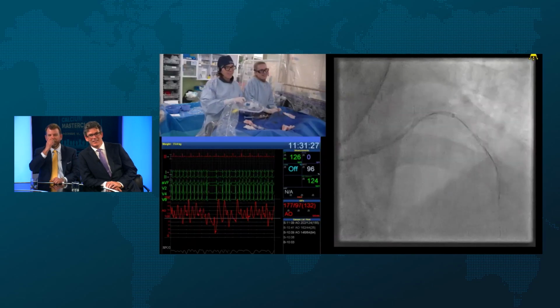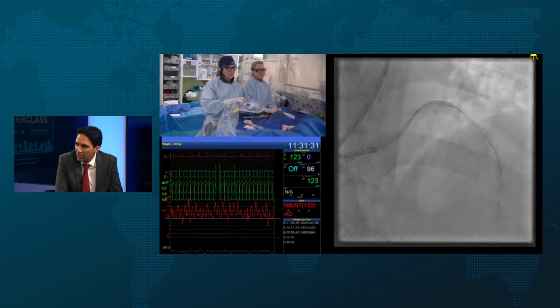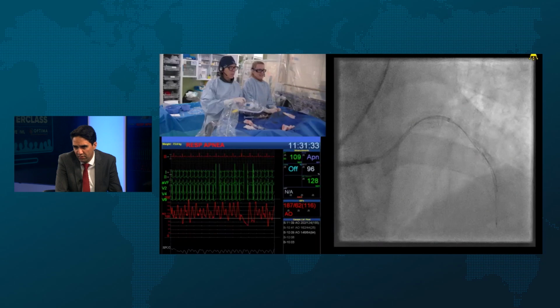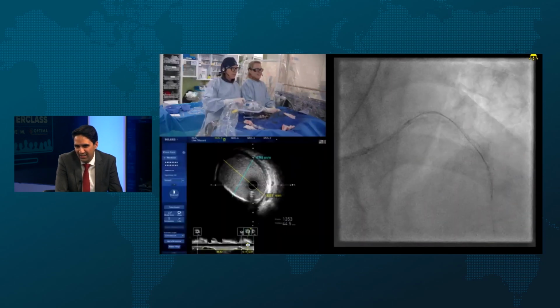So maybe go live on what made you guys choose IVUS over OCT? Was it the GFR? Was it the patient age? It might just be preference. You're making Ziad a bit upset, so if we could just talk about that. Let Claudia answer and then I'll tell you why for me.